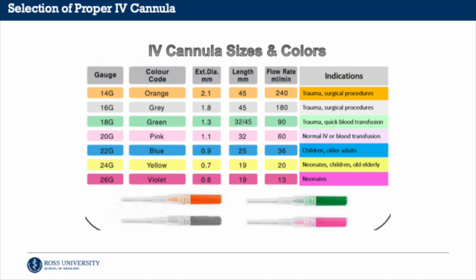Here is a chart representing the gauges of the cannulas and their associated colors.